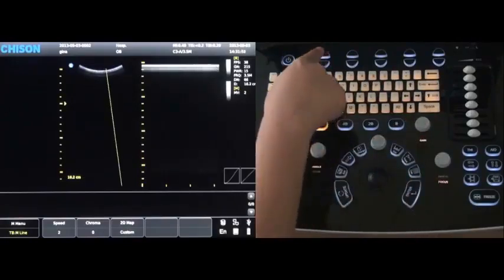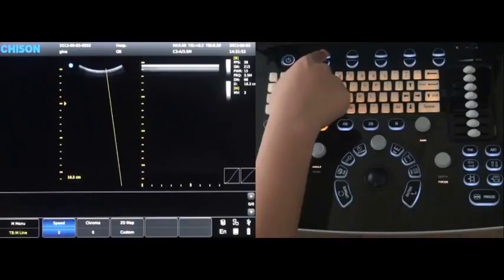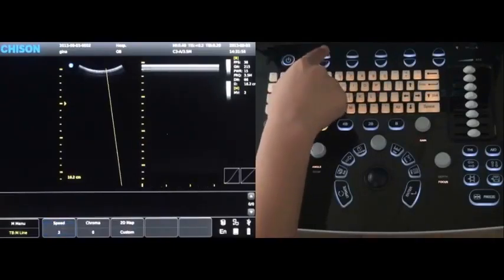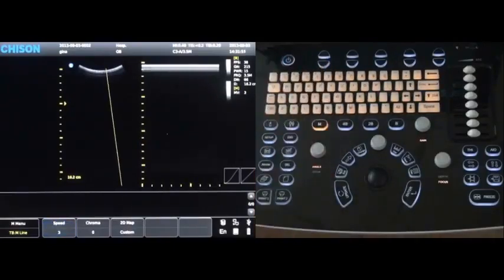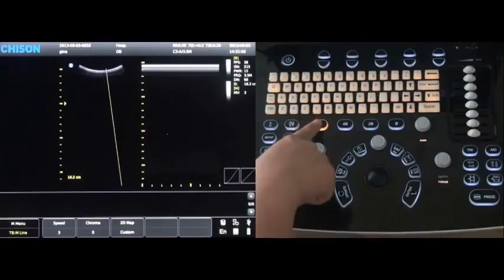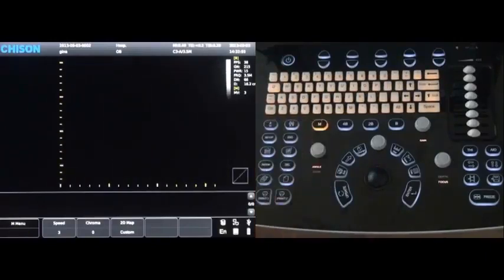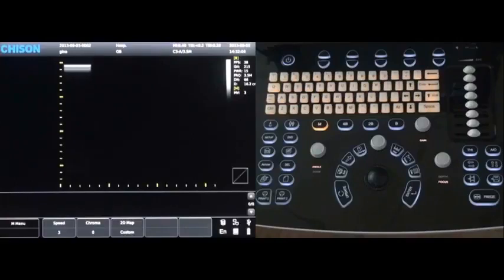Press the first T to change the M speed, fast or lower. Press the menu M key again, you can get the M image only. Then freeze.